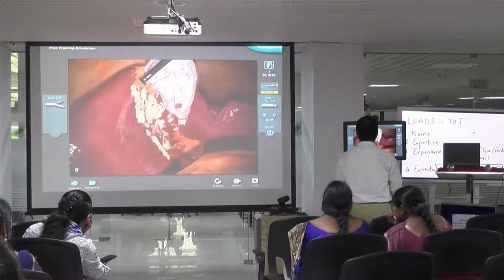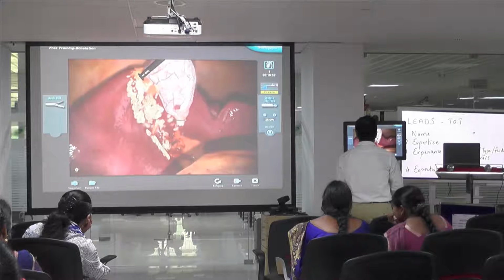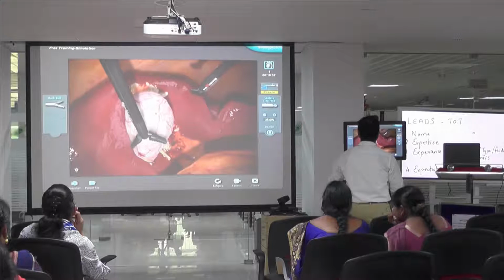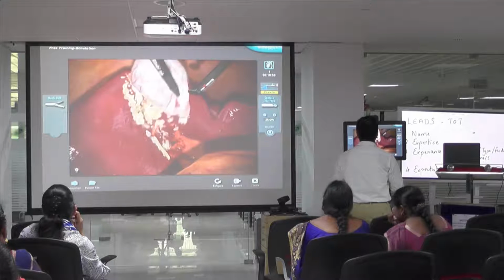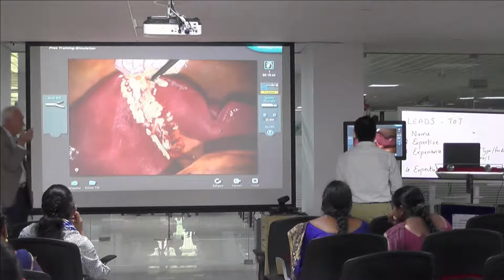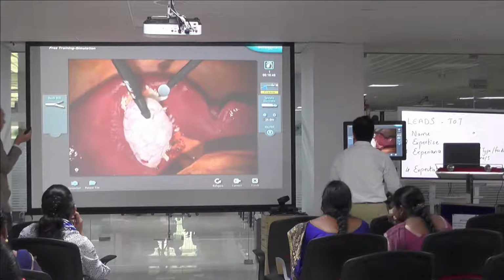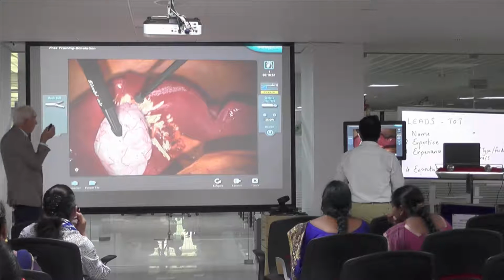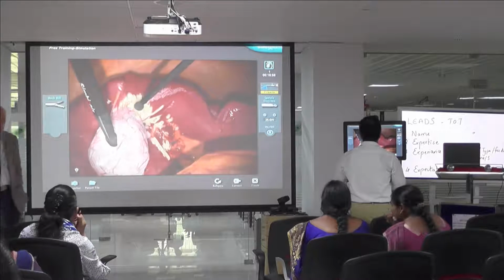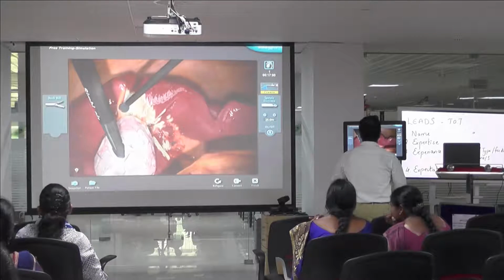Otherwise, you need to pull this gallbladder through one of the incisions, preferably in some kind of plastic bag or retrieval bag, to avoid spillage of maybe contaminated bile into the wound of the patient. But it goes here automatically, so you'll see that the retrieval bag shows up and the gallbladder is gone. So we had another task accomplished.